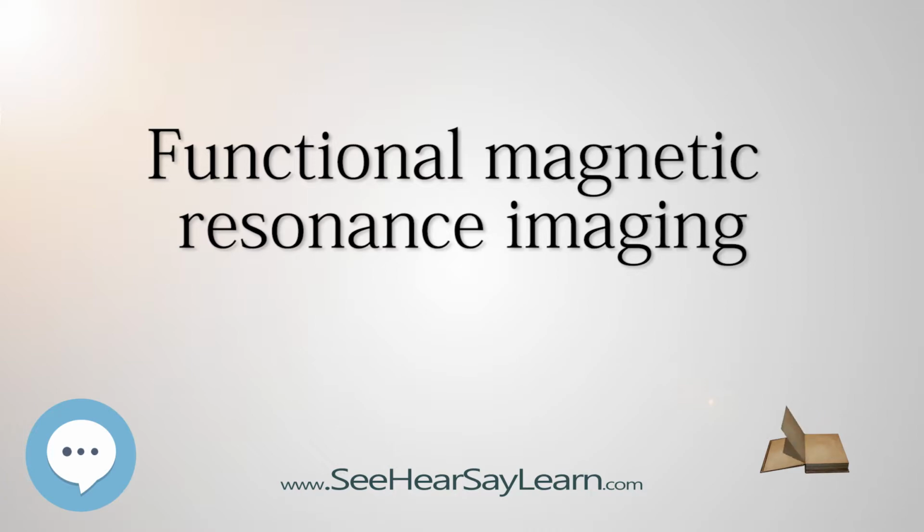Temporal resolution. Temporal resolution is the smallest time period of neural activity reliably separated out by fMRI. One element deciding this is the sampling time, the TR, below a TR of 1 or 2 seconds. However, faster scanning just generates sharper HDR curves, without adding much additional information, e.g. beyond what is alternatively achieved by mathematically interpolating the curve gaps at a lower TR.